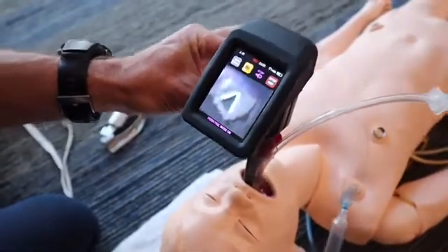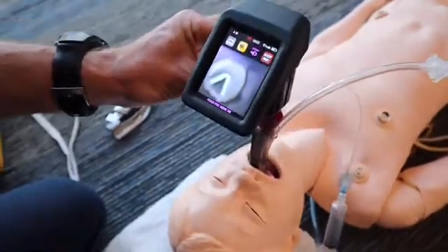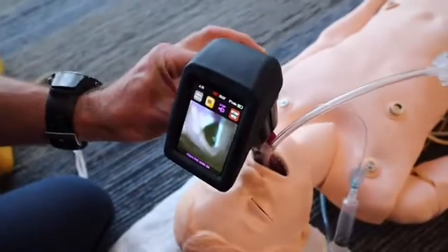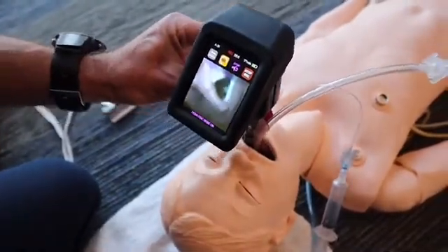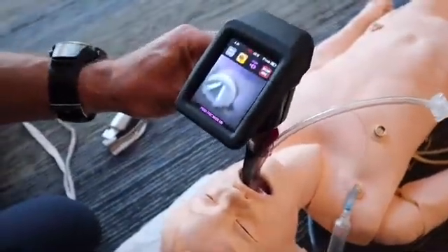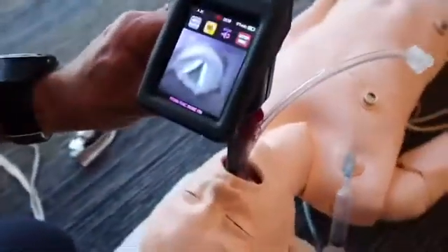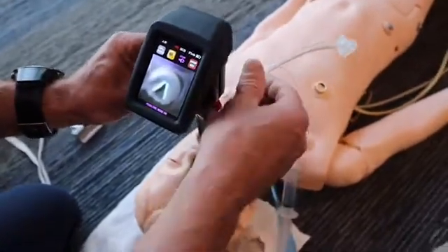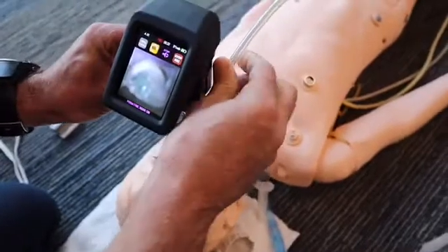The biggest mistake we've noticed is people inserting the blade too far. You can still see the cords but you're not going to be able to pass the tube effectively. Insert it just into the posterior oropharynx where you can see the vallecula — the blade kind of seats into the epiglottis — and then insert the tube through the vocal cords.